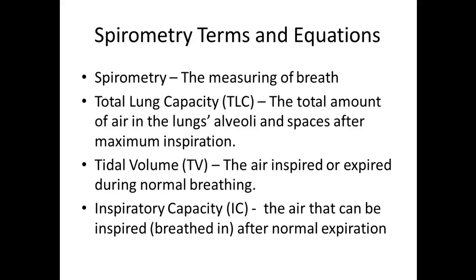Inspiratory capacity, or IC, is the air that can be inspired or breathed in after normal expiration. So if you take a simple breath out and then you take a deep, deep breath in until you can no longer breathe in, that amount of air that was breathed in is called the inspiratory capacity.